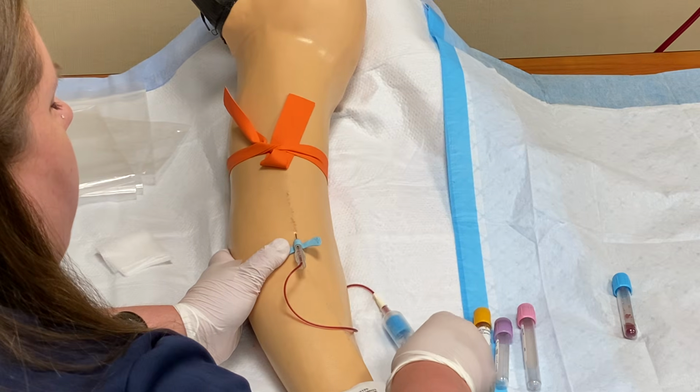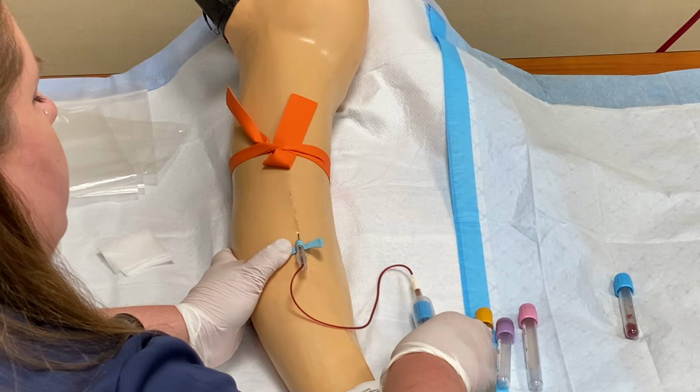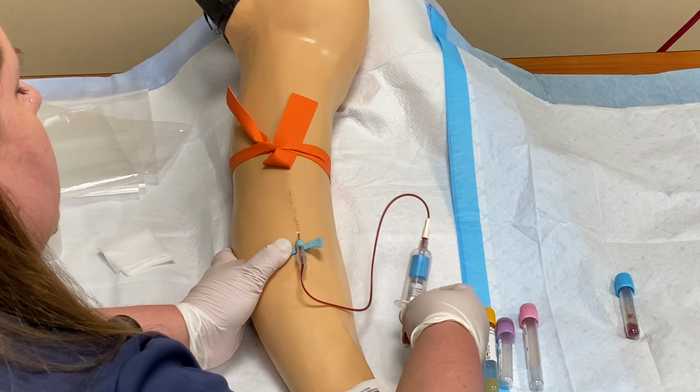So I will let them fill until I notice that the blood has stopped filling the tube. I wanna make sure that I always keep my tubes either horizontal or at an angle. I don't want them straight up and down when they're filling because I don't want to risk hemolyzing the blood.